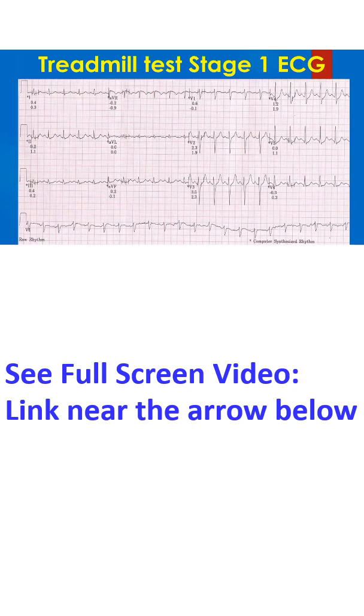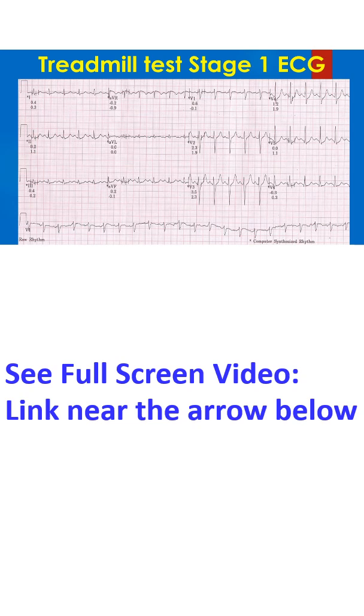ECG recording in stage 1 of the Bruce protocol of treadmill exercise test. The heart rate has increased and there are not many artifacts, and no significant ST segment shift is evident.